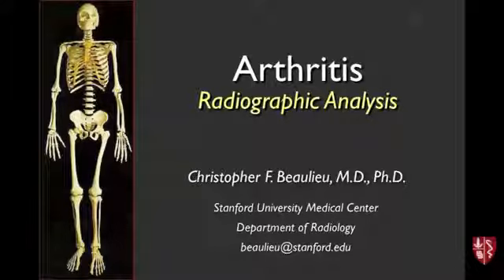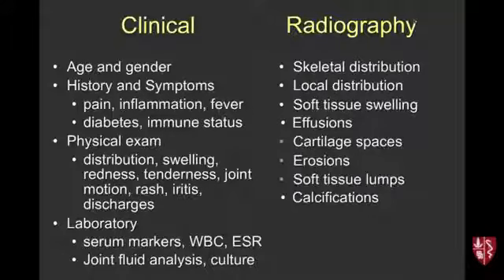reasonable volume of it that comes through here, but the key take-home point is that it takes quite a bit of careful analysis and a good background on the clinical syndromes of arthritis in order to do a good job with the radiology. I just have really one text slide, then we'll get into the cases.